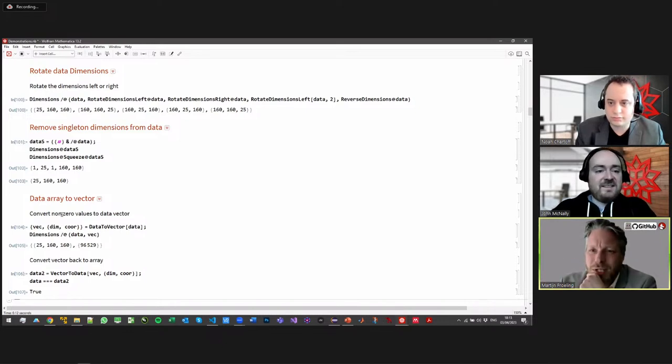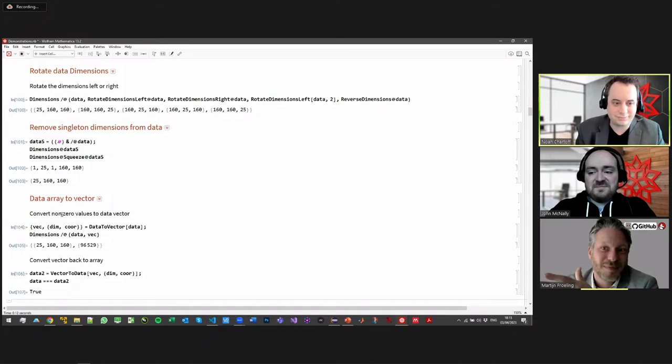in general, you don't notice it. Most of the things you do once, but when you start looping over huge data sets, over millions of voxels, then the difference between a millisecond or 10 milliseconds makes a huge difference, because it's a factor of 10. So when you fit a function and this function fit takes 1 millisecond, I'm happy. But if it takes 10 milliseconds, I'm not happy, because that's the difference between a day and 1.5 weeks. That's a factor of 10.